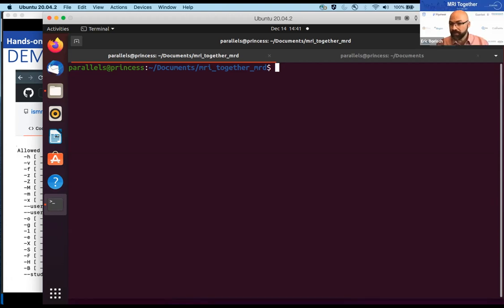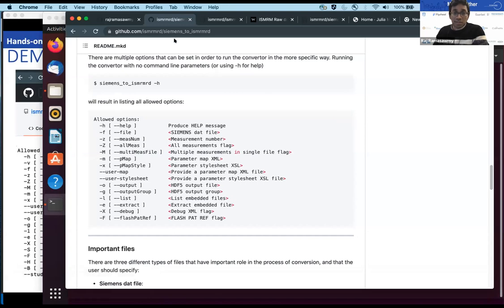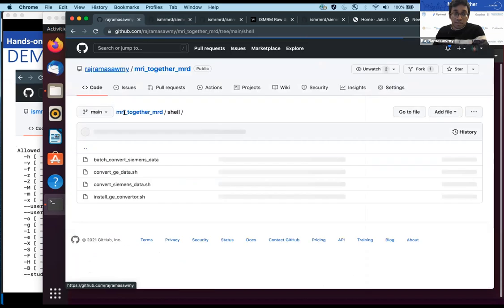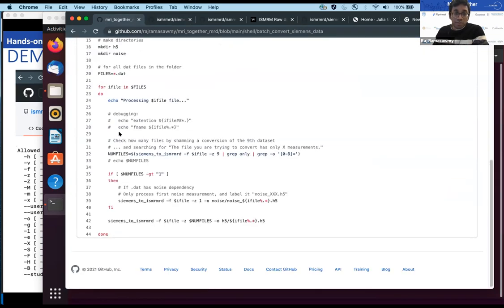Is it possible to select the last measurement? Essentially, that's what I do in this script that I've shared with you. If you go into the shell and ignore the for loop, you can just query it with that large number, since I've never seen an experiment have more than three components to it, and then just take that number and convert it here. That will just do just the last.